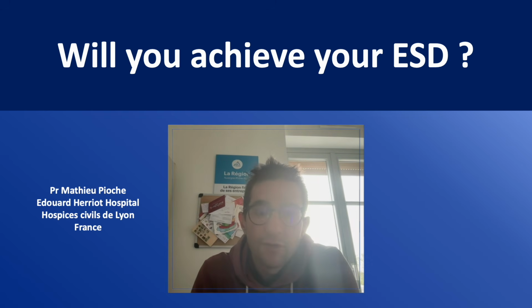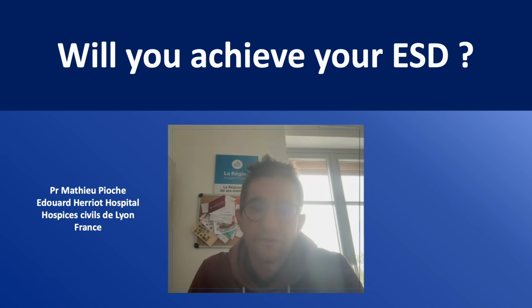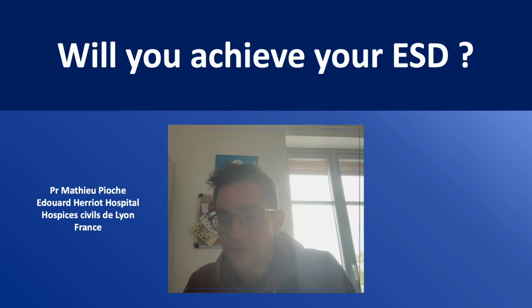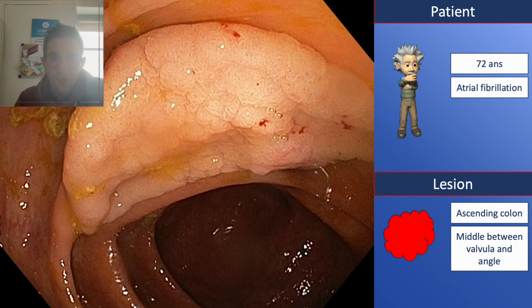We will do a different episode from usual. We will go into a case of ESD in the colon and try to escape from this case with a lot of key points that are, I think, very important to deal with this kind of lesion. So first, what is the case?